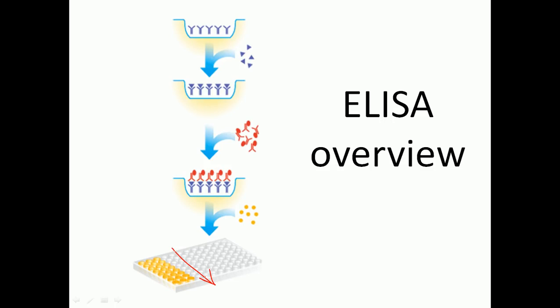Whatever sample we take, whether it's an antigen sample or antibody sample, generally it's a patient blood serum sample, it is continuously diluted. As we dilute this sample throughout the wells, we can detect the percentage of antigen or antibody present in each different well, right? That's why we can understand it quantitatively, and we can also tell the exact concentration at the picogram level. We can construct a graph with these values, and that's why ELISA is very important, guys.